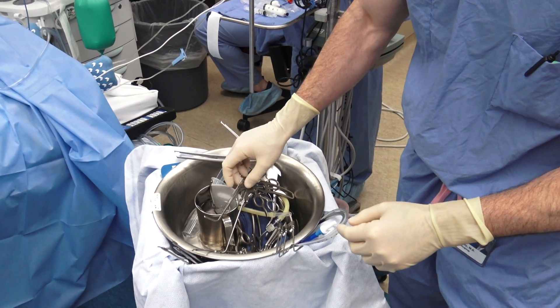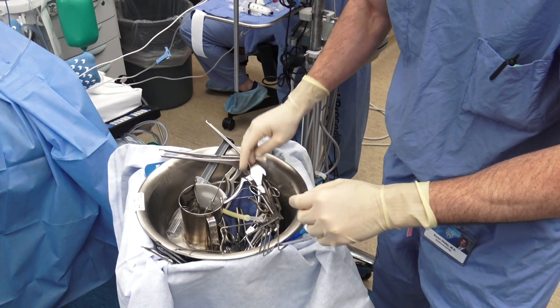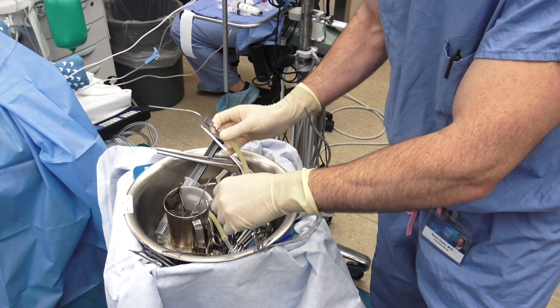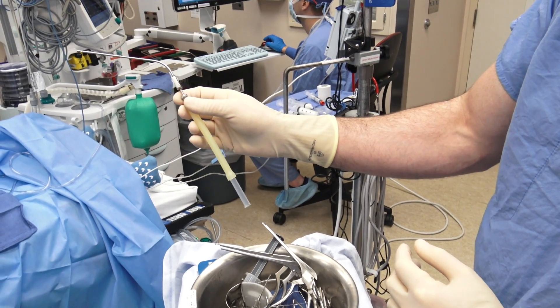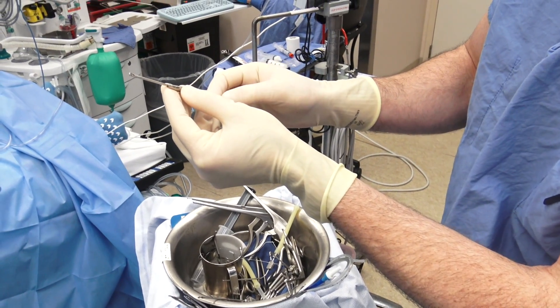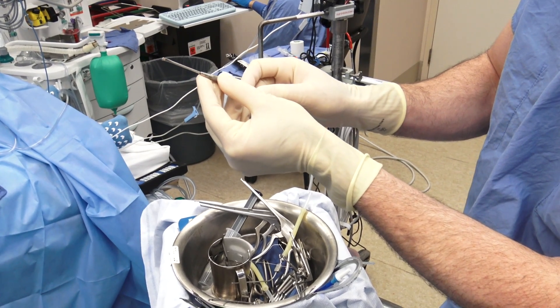The last thing I'll show is some of our suctions and suction elevators. These are our standard suctions — numbered, with larger sizes being larger and smaller sizes being smaller. They're marked in French, such as an 8-French straight suction. This is our suction elevator, also called a suction freer, which is helpful for dissecting nasal septal flaps and septoplasty-type surgeries.